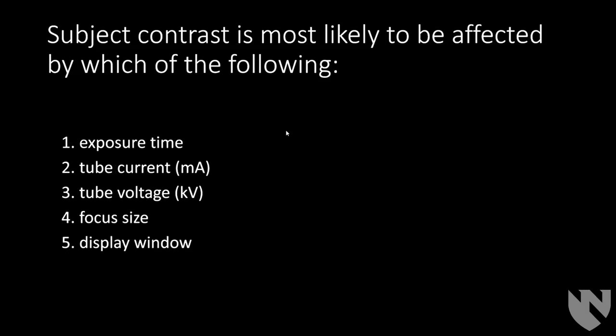Okay, subject contrast is most likely to be affected by which of the following? Not something we've covered, but if you've done the modules, you might remember. The answer to this is the tube voltage.